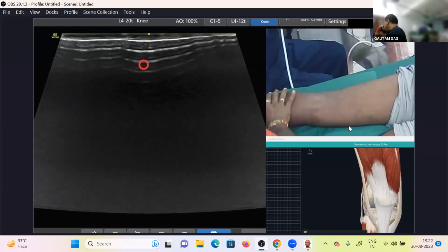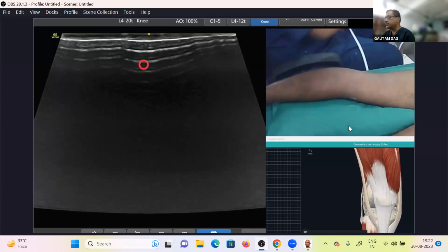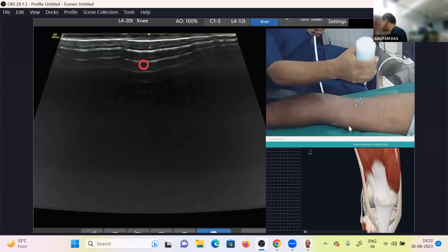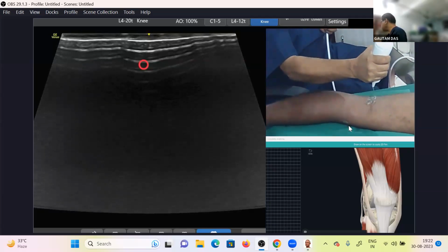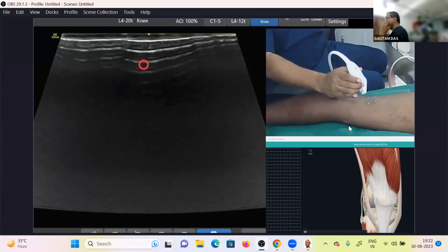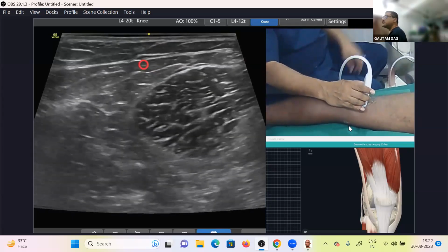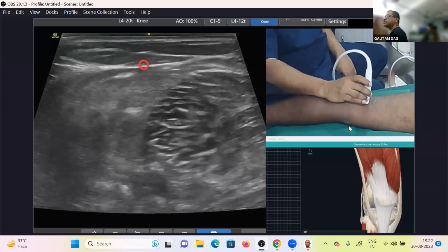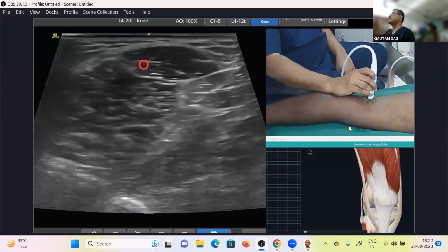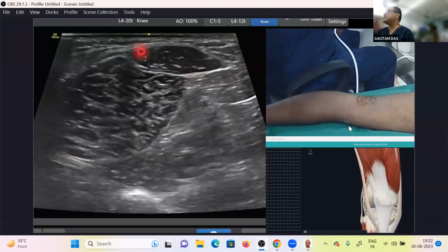The knee is a little bit extended, hyperextended. Otherwise, it's difficult to show the different structures. So you remember, lateral side two muscles, medial side two muscles. Lateral side, what are the two muscles? These are the two muscles. This is one muscle, this is another muscle.